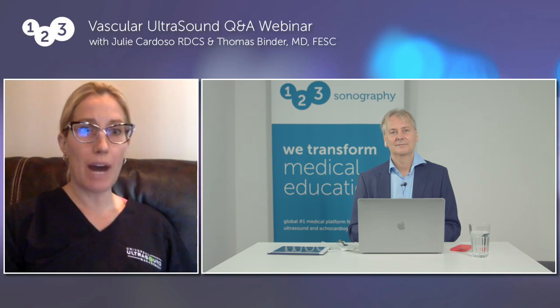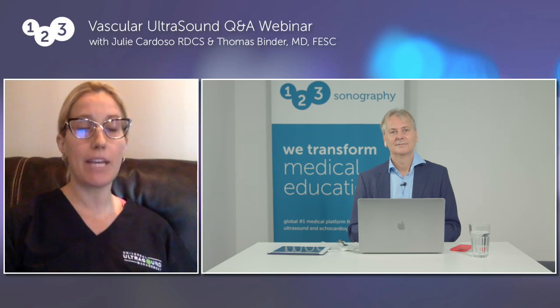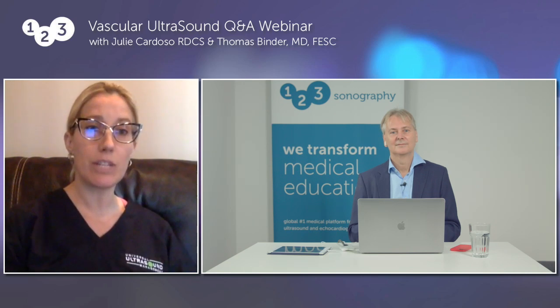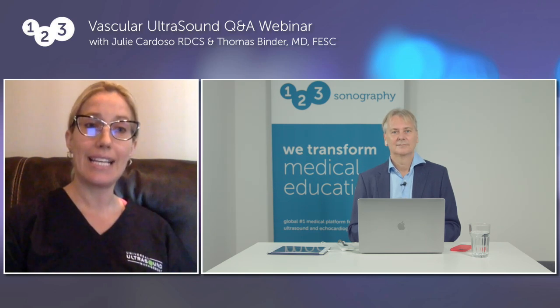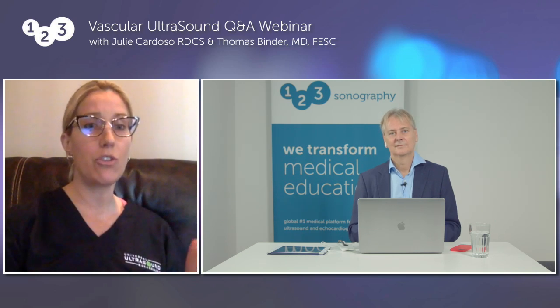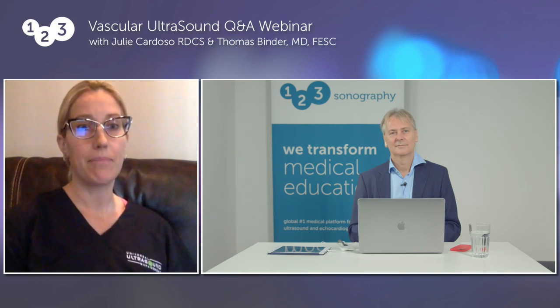Well, we got to use the different tools in our toolbox. We got to know the knobology of the ultrasound system and how to optimize our image, whatever transducer we're using. But for instance, when reviewing the veins or the artery in a patient with a higher BMI in the mid-thigh to distal region, it's important that we understand that with a linear transducer, we're not going to get good penetration greater than 4 centimeters depth. So at this point, I would utilize the curvilinear transducer, which is a lower frequency transducer that will allow me to penetrate deeper into the body to view this vessel. And again, knowing about the knobology, we want to make sure we know how to adjust our frequency to make it lower, to image deeper into the body, our gain settings, and also our time gain compensation. Those are the three basic functions as far as how to get a good image of vessels that are deeper into the body.